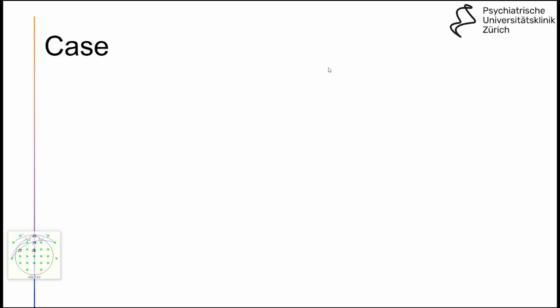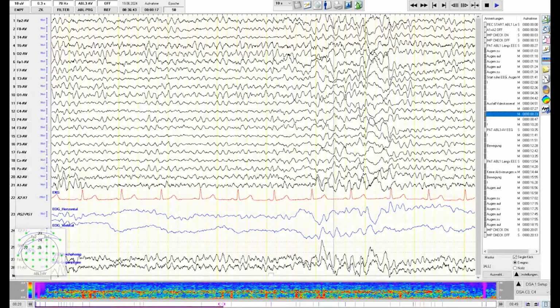And you have mentioned a differential diagnosis between depression and dementia. Would you suggest also to use EEG for a differential diagnosis between depression and ADHD? Yes, because of the hyperactivity or hyperarousal, we will get to that when we talk about sleep and vigilance. I think there are some signs that could be helpful to differentiate between that. The evidence is not there yet that you could use it in the standardized procedure.